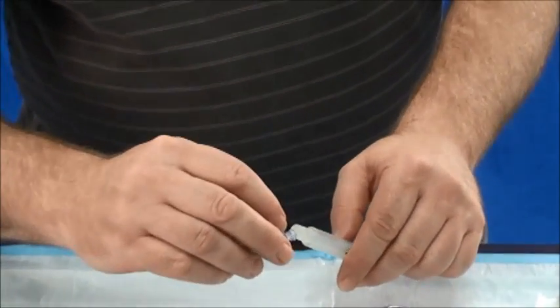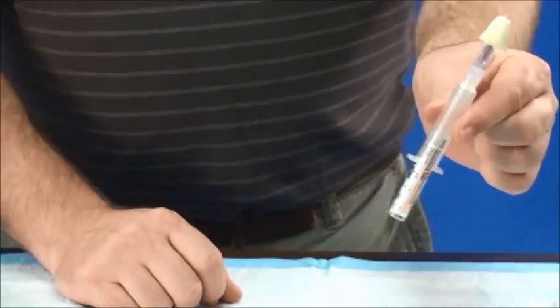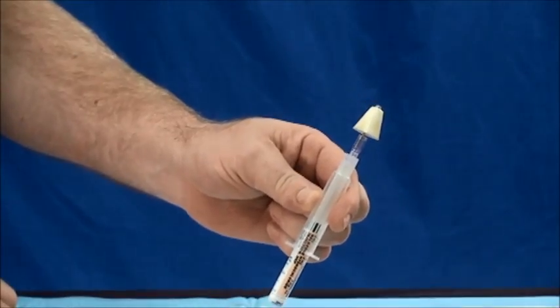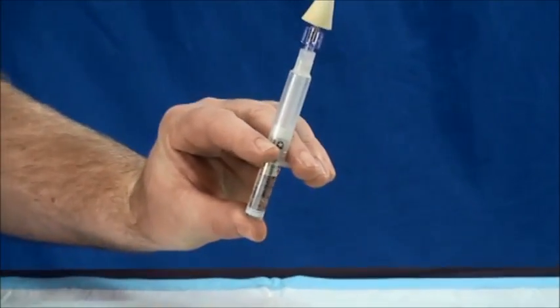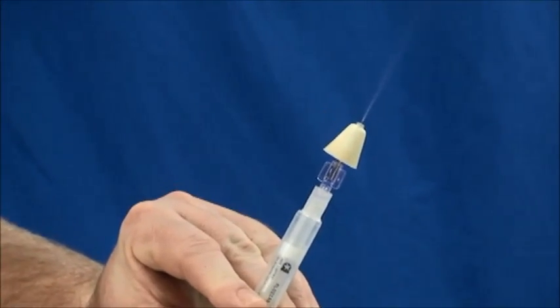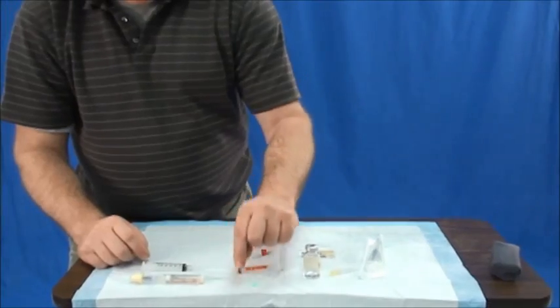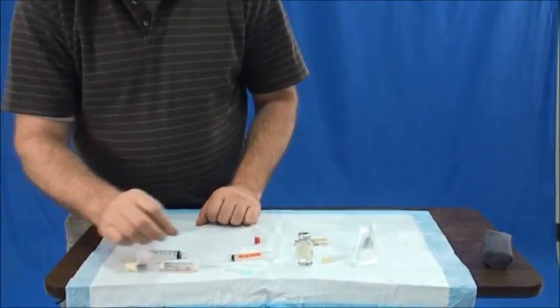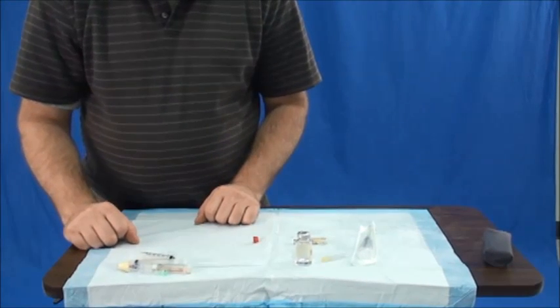Take the atomizer and attach it. We can give our doses in increments up to two milligrams. As with any medication, once you've completed delivering, you must dispose of it in proper containers. Anything that is sharp, go ahead and put it into your sharps container. That is how you deliver naloxone.